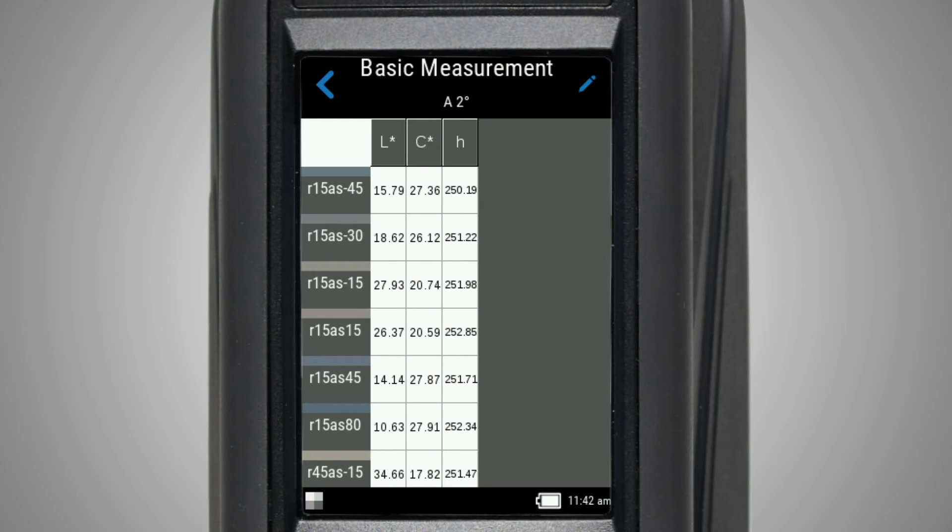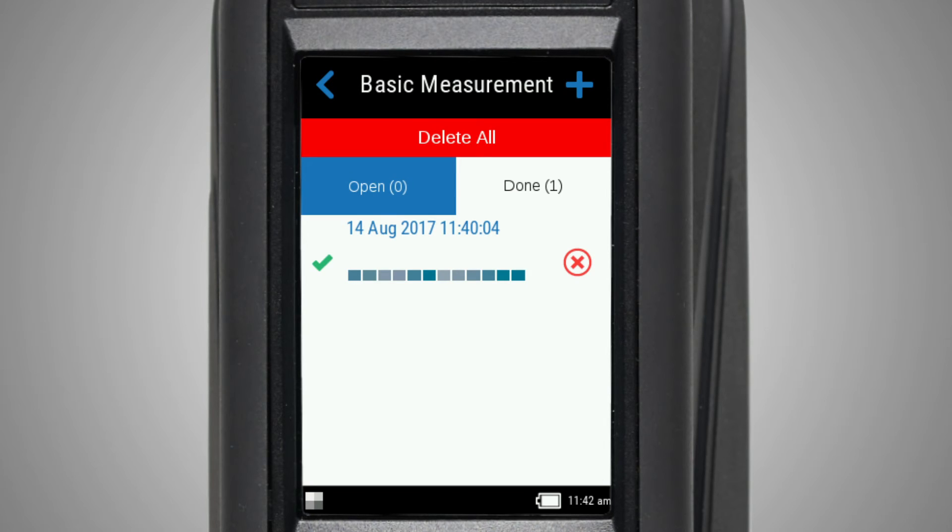Once finished viewing your data, tap the back icon. This measurement is saved here in your measurement list. Tap the X if you wish to delete it. You can also use delete all to remove all your measurements.